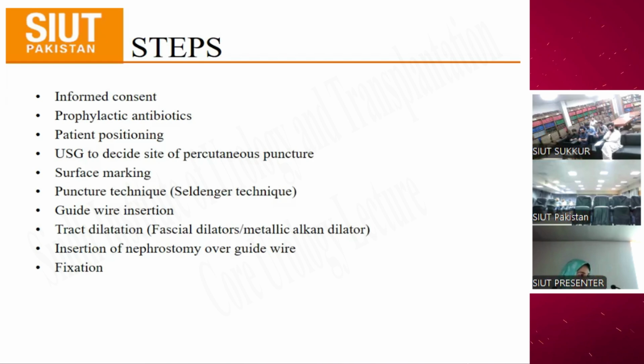For instance, if you have to insert a 6 French, no problem, you have to dilate up to 8 French. If you want to insert an 8 French nephrostomy tube, you have to dilate up to 10 French. So you have to tell all these steps one by one.